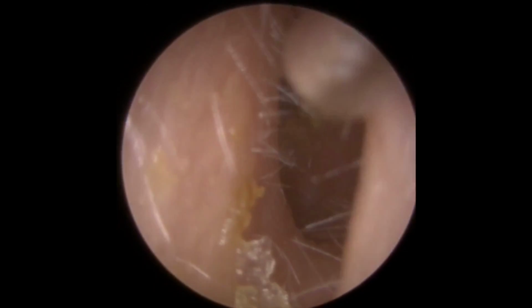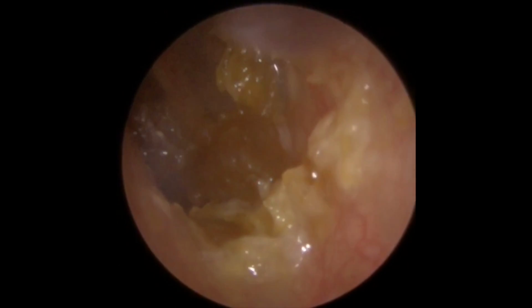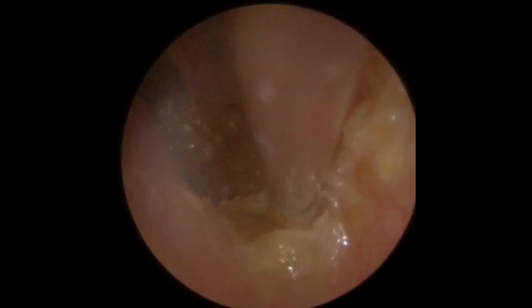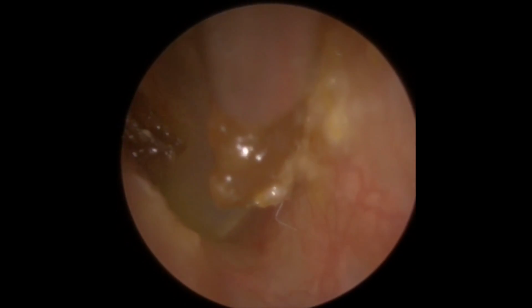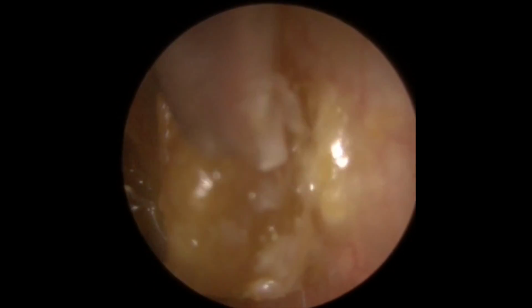because the canal was so narrow, it left me with very little movement near the eardrum. So what I'm doing here, I'm trying to sort of guide it down. I'm going to aim for the sort of bigger bits that are close to the actual drum itself. So I can get to the bottom of the drum quite well, but I can't get to the attic. I just can't get the angle to get up there. So I'm going to take all these larger pieces away.